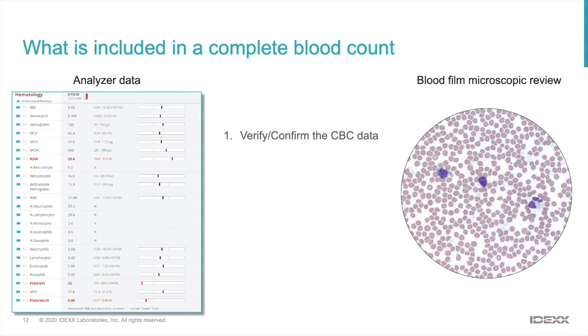I think most of you were taught that the blood film microscopic review is the way to verify the results. However, that's a big problem because we know that much less than 10%, and actually closer to 5%, of the in-clinic CBCs actually get a blood film review.